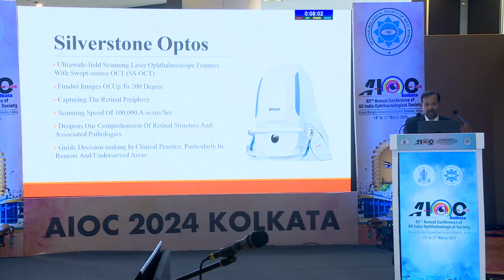But I think sometime maybe a year or 2 years back, we had this particular instrument called Silverstone Optos. I would like to mention that I have no financial interest. So Optos, we know that it captures up to 200 degrees of retina in a single click, and it can capture up to the ora if we take the steered images. But till recently, we did not have the ability to do OCT with this machine. With the onset of Silverstone, we had this swept source OCT incorporated into Optos, and with the help of that, we can capture the OCT of peripheral retinal structures.